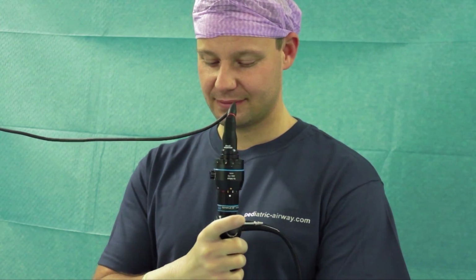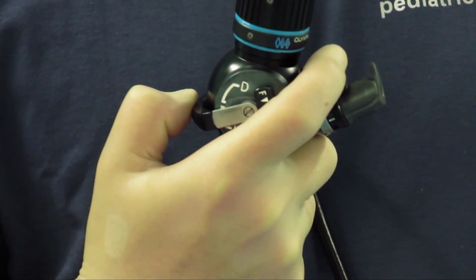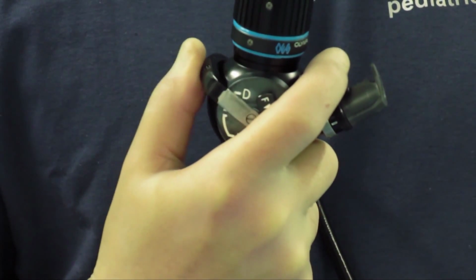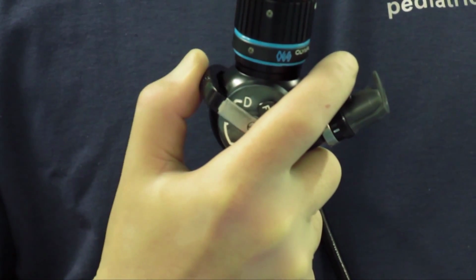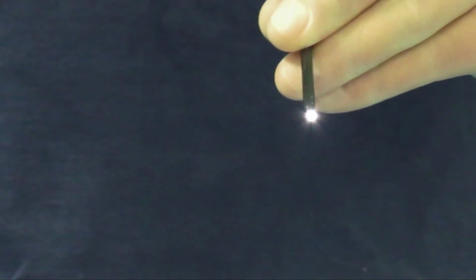How to do it? Hold the handle with your dominant hand so that your thumb moves the shifter to bend the tip of the scope. Your index finger operates the suction valve. The left or non-dominant hand holds the scope near the tip.